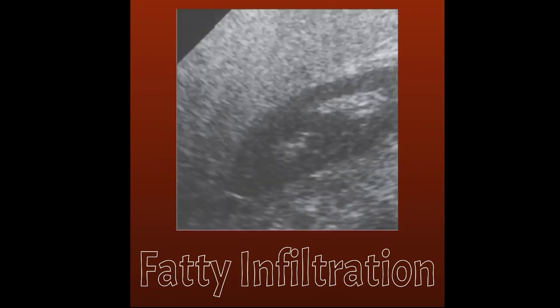Here's another example then of some fatty infiltration. We can see that we have a very echogenic liver. We always like to compare the echogenicity of the liver to the echogenicity of the kidney. So we like to compare that interface. Typically the liver is much more in line with what the renal parenchyma is. This much of a difference also helps to indicate fatty infiltration.